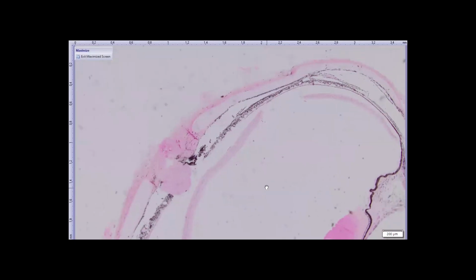Well, not much better. So turtles have cartilage. They have bone. You can see the scleral ossicle here. I don't know if they have a fovea or not. This section doesn't prove it, but they do not have a conus papillaris. You have to take my word for it. It's not shown here.